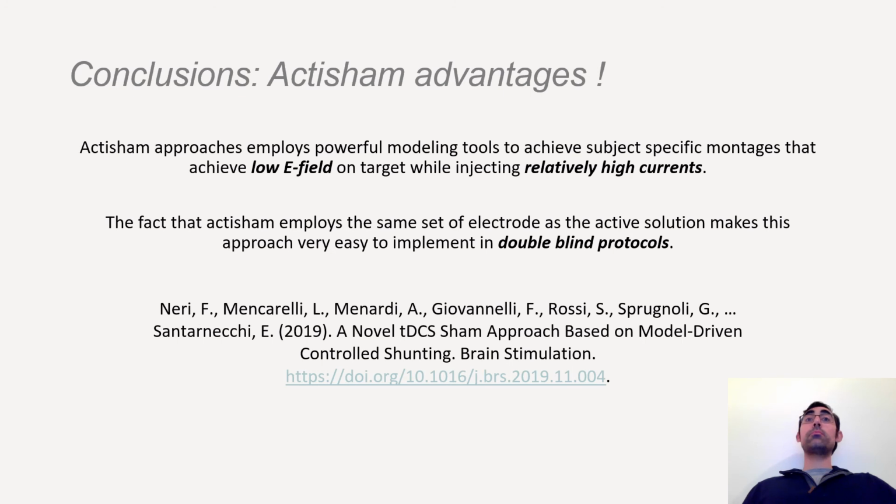And we have already applied this approach, the actisham approach, in a study targeting the primary motor cortex, and I highly recommend that you go and download and read this paper if you're interested.